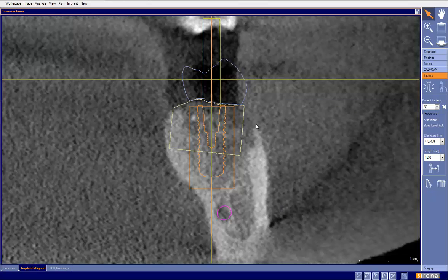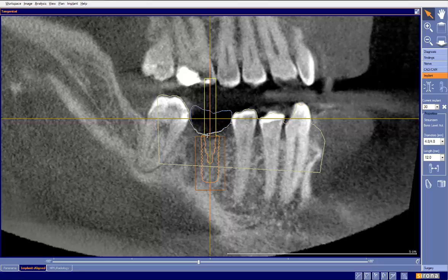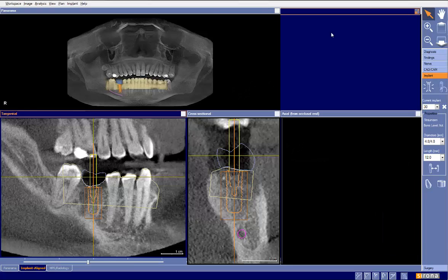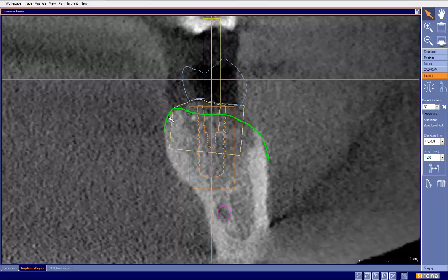What I'm noticing is, right here, this yellow line represents our tissue height, and this is a planned implant. To me it looks like the implant is planned at the height of the tissue. Even here in the buccal-lingual view, we can see that we're at the height of the tissue. My guess would be that the bone is actually right down here. Sometimes with patients that are bigger, we have a harder time seeing that. So to help us here, let me go ahead and outline what I believe to be the bony outline of this case — that green line represents what I believe to be the bone height. So, even though we have a bone level implant, it looks as if it's planned at tissue height, based on the data that were presented.